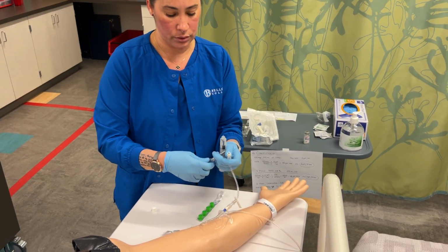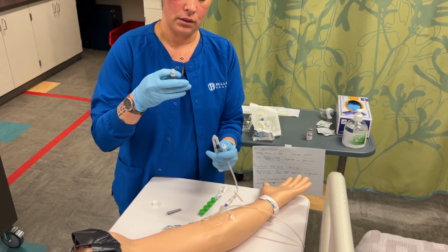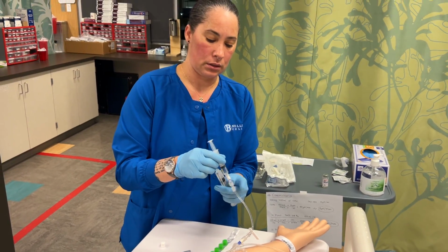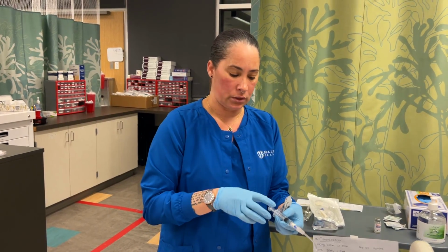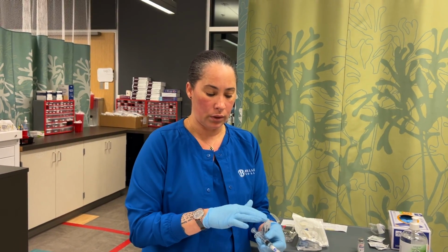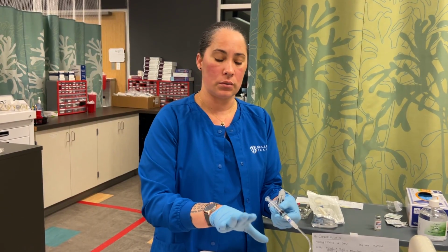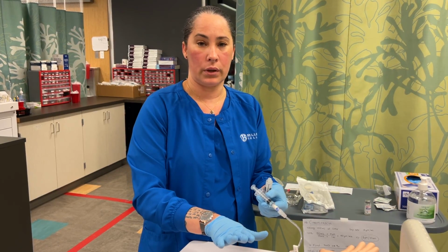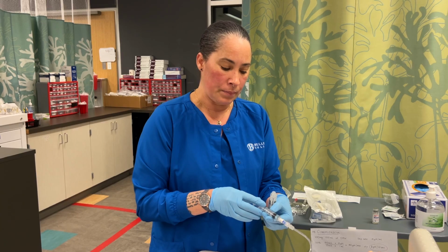Now we're going to administer our medication. Now this medication you need to administer over 2 minutes. It's not safe to just push it in there. So just over 2 minutes, you're going to slowly give the medication to the patient. While you're giving it to them, again, assess the site, making sure there's no redness or swelling or edema, and that the patient's not feeling any pain or any weird effects of the medication. You'll want to make sure that they feel okay.